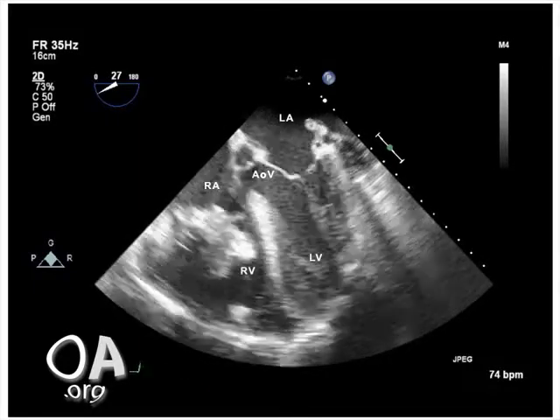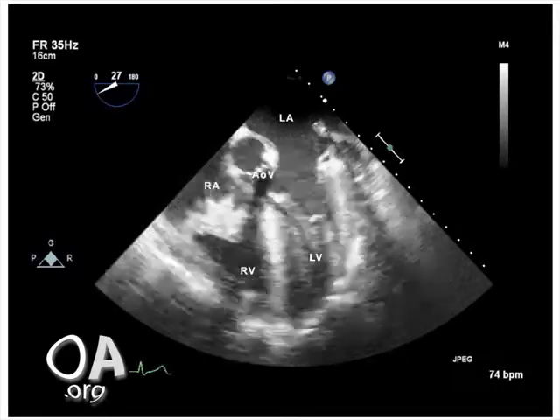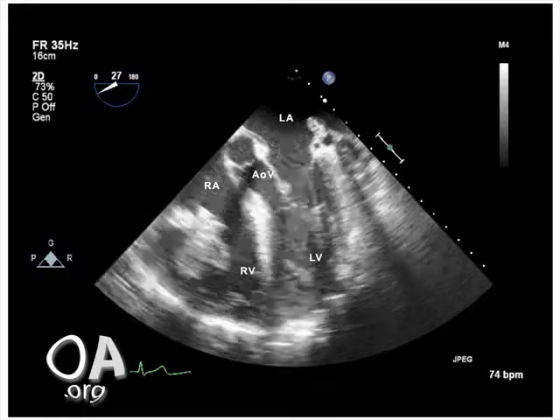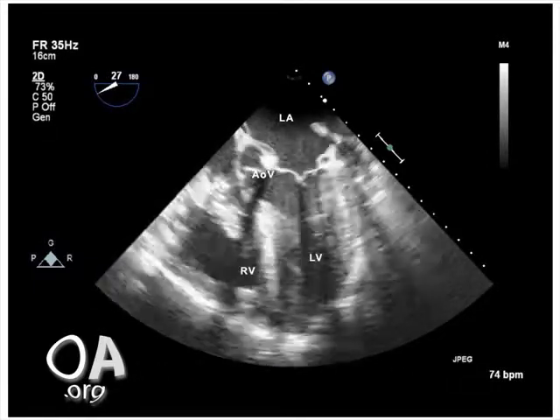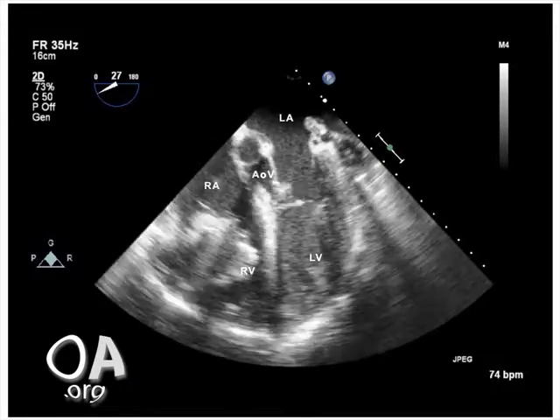In the OR immediately before the surgery, this is the mid-esophageal 5-chamber view, so called because it allows visualization of the right atrium, right ventricle, left atrium, and left ventricle, as well as the left ventricular outflow tract. Again, prominent in this view is the right-sided tricuspid valve vegetation.